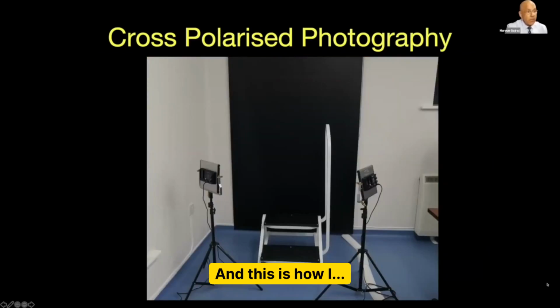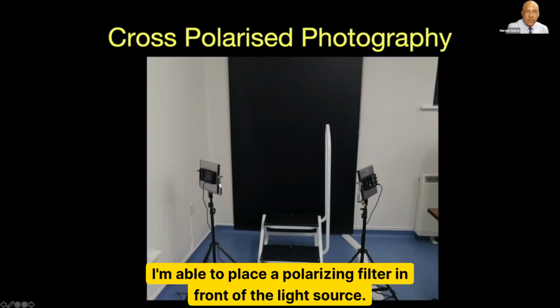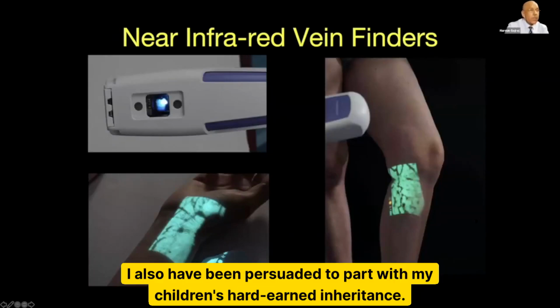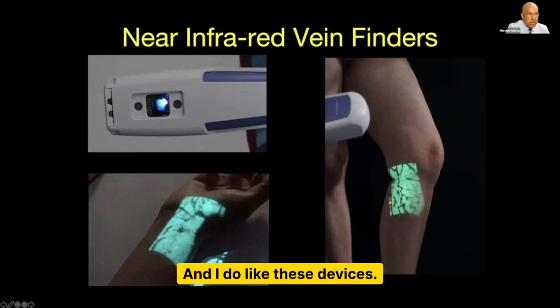And this is how I perform cross-polarized photography. I have bright LEDs. I'm able to place a polarizing filter in front of the light source, and then with a circular polarizing filter on my DSLR camera, I can take cross-polarized photographs. I also have been persuaded to part with my children's hard-earned inheritance, and I've bought myself a near-infrared vein finder. And I do like these devices.